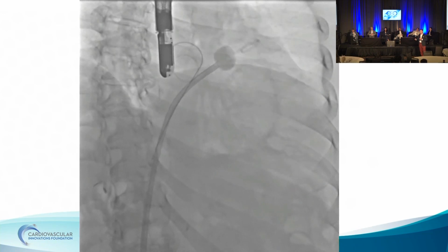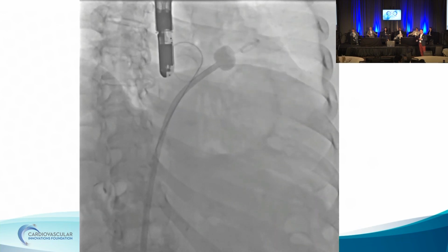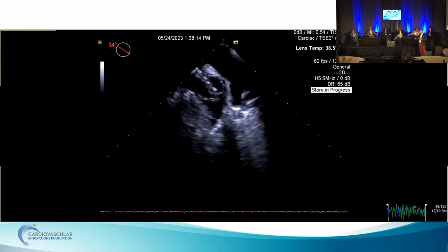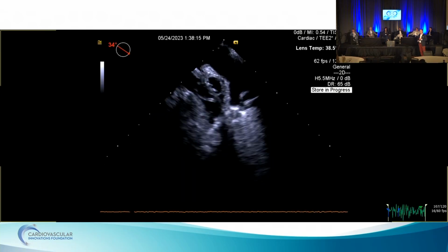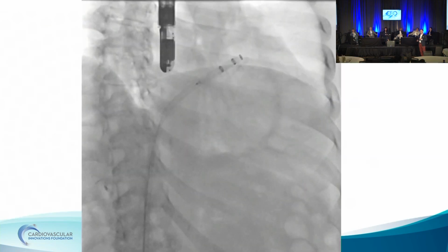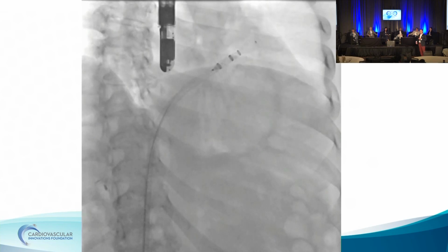So that's just us twerking around with our pigtail catheter, and so we have essentially cerebral embolic protection from the Sentinel, but also from the balloon occlusion of the ostium with the SafeCross balloon. So here we see that the thrombus is gone in the tip of the appendage, and we still have our balloon there. And no more thrombus, although I'll tell you there was a lot of smoke very quickly starting to reaccumulate. And so we used that buddy wire to rapidly exchange for our Watchman delivery system and deployed.